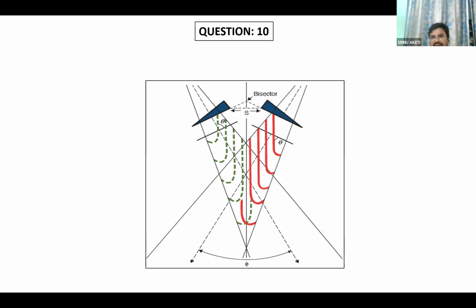Okay. So any idea about hinge angle? Sir, hinge angle is the angle between the central axes of two intersecting beams. Two wedged beams. Yeah, angle between central axis of two wedge beams. So what is the clinical significance of hinge angle? What is the importance of hinge angle?